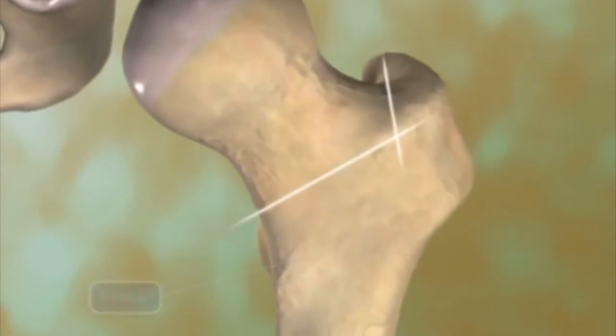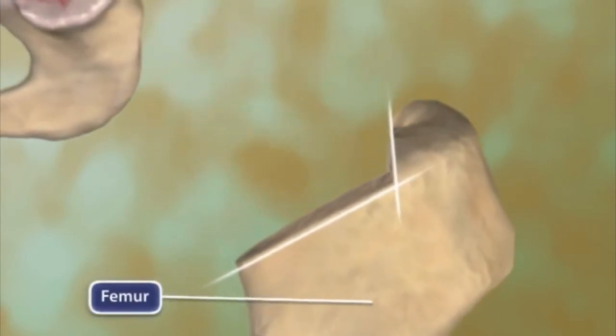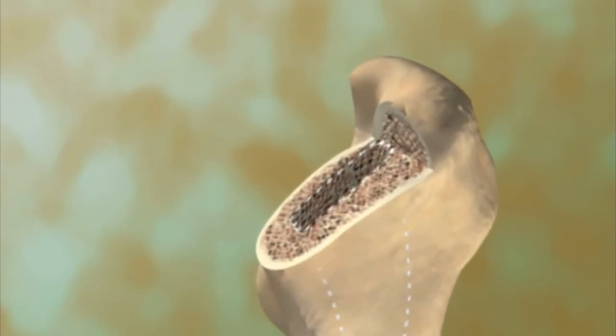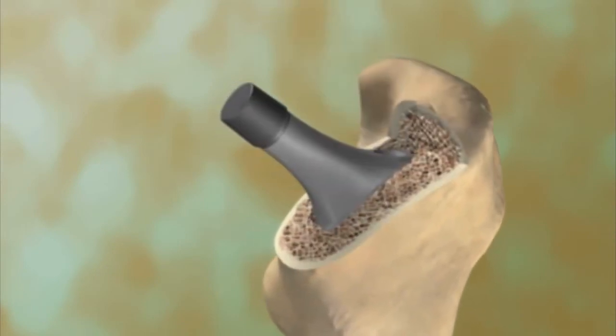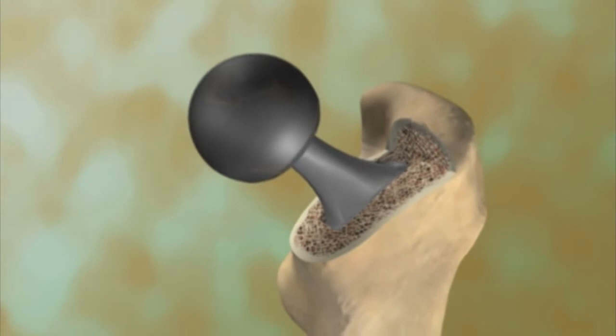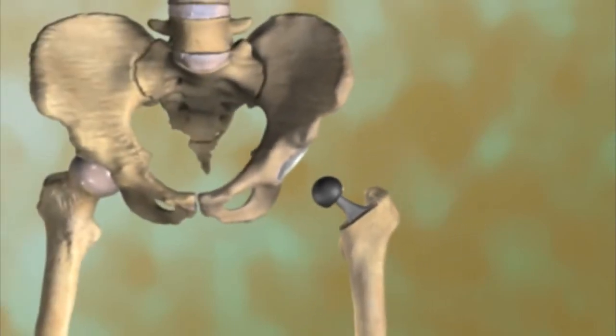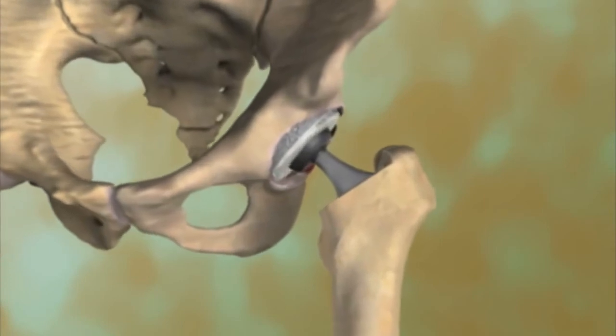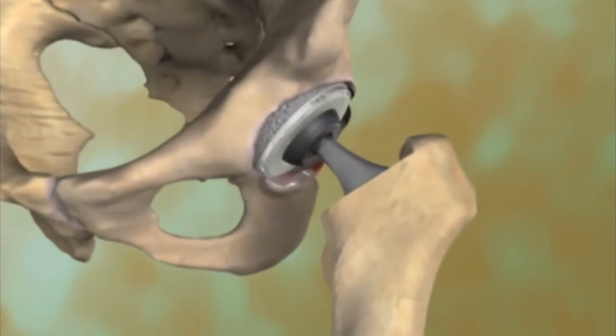The next step is removing the ball-shaped head of the femur, or thigh bone, and preparing the femur for placement of the stem portion of the component. A metal ball is attached to the end of the stem and fits into the artificial socket in the hip bone. Together, these components replace the natural ball and socket joint.